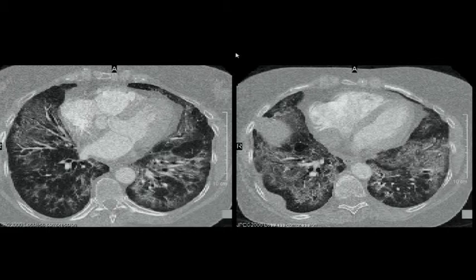So ground glass opacities, sparing the periphery. Any diagnosis right now? Because you're using buzzwords, right? Sparing the periphery is a buzzword. When I say a buzzword, it is one that indicates only one thing or one or two things, right? Okay.